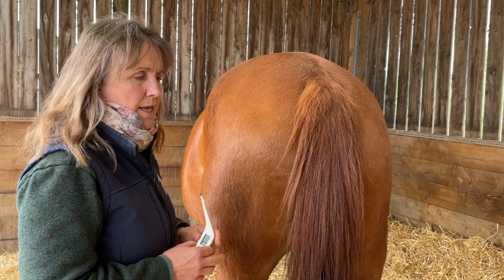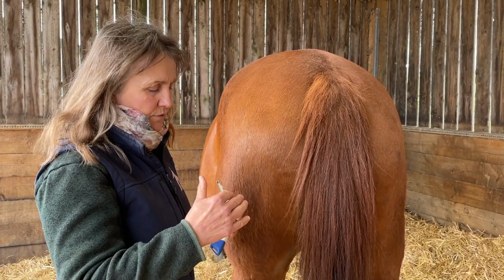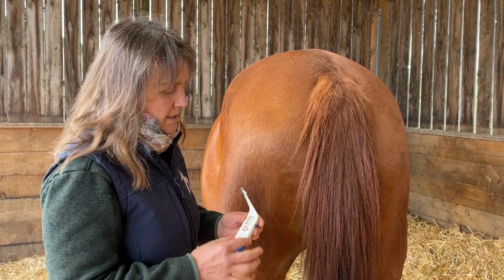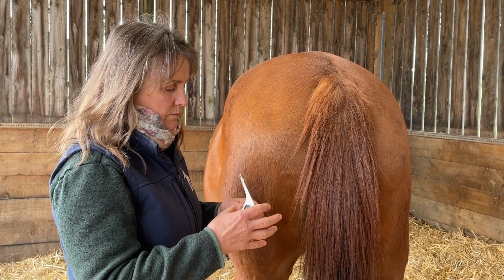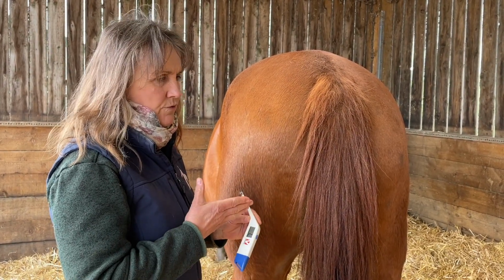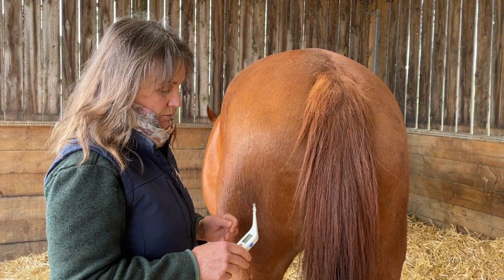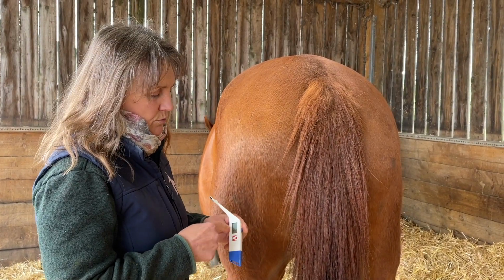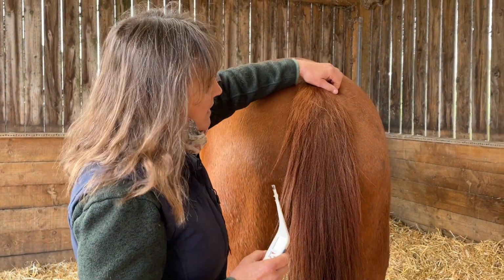So as long as you insert the device into the rectum sufficiently far, and the fact that it widens and becomes bigger is telling you that you're at the hilt. And even the smaller ones, they're there to make you realise that you've gone far enough. So certainly you wouldn't be aiming for any more than half of the length of a normal small thermometer. You've got to fire it up and you will get low setting and the flashing degree C.